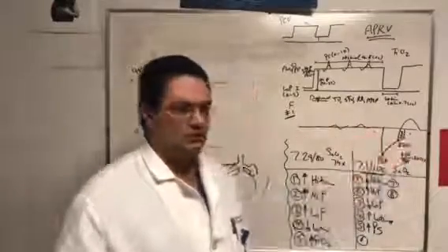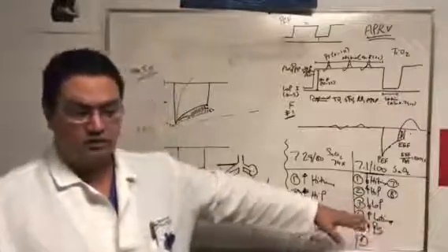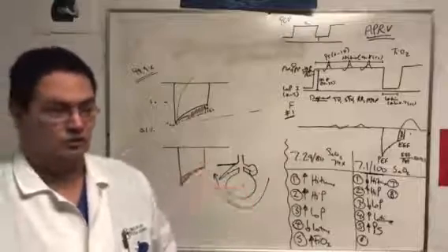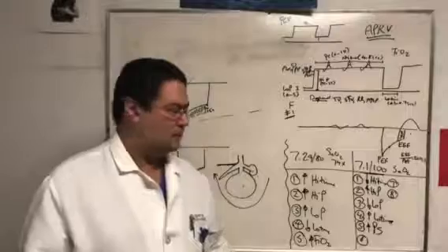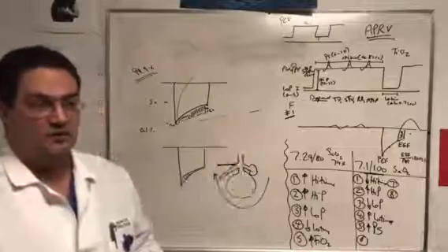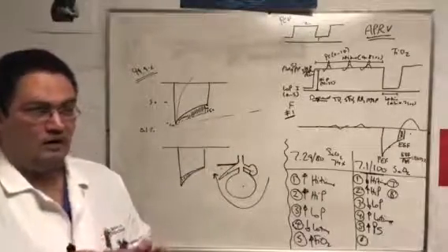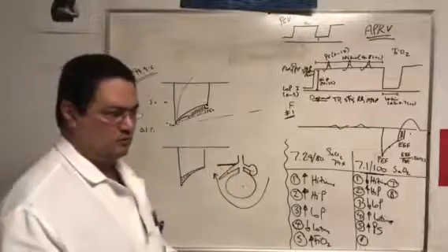That's more area under the curve or whatever. But even though you're still within the ratio, the higher the ratio, the better the recruitment. The lower the ratio, the less the recruitment. So you're throwing in the towel very early. Why not do all the others, right, and wait? At some point, everything is going to improve. Everything is going to recruit. If you just wait and go over the hump, then everything is going to improve, and you don't need to increase the low time anymore.